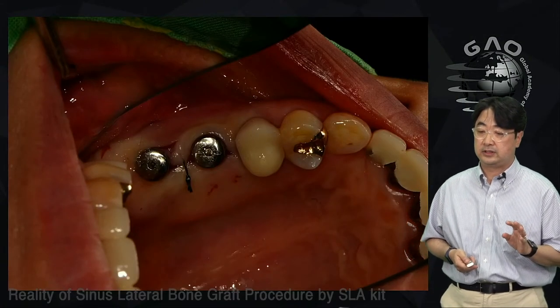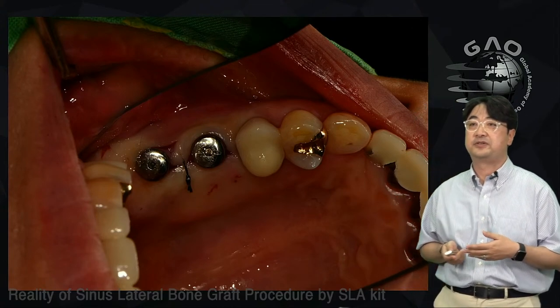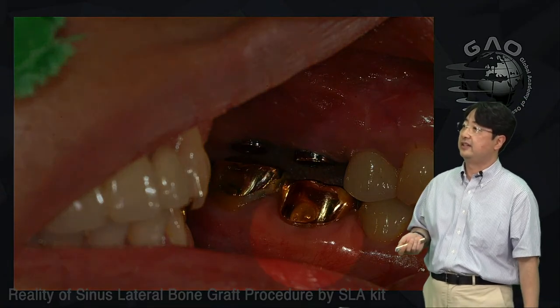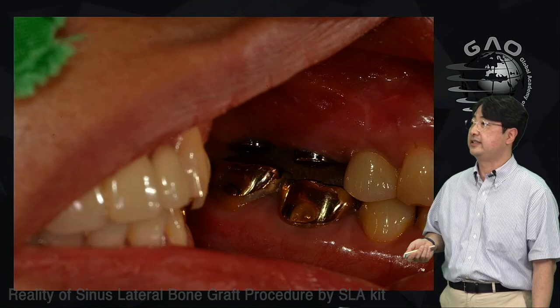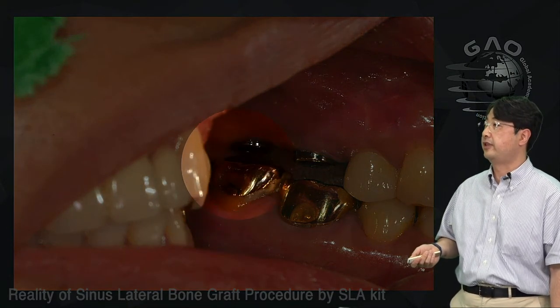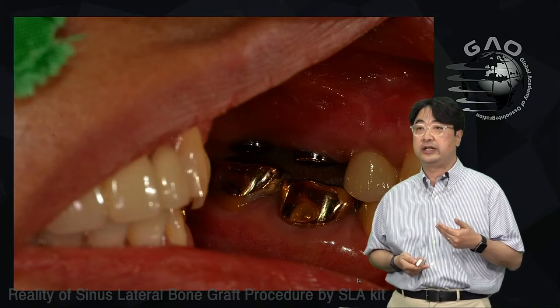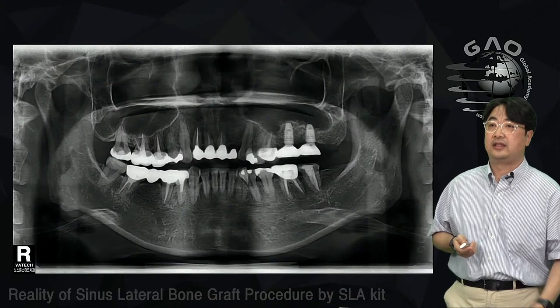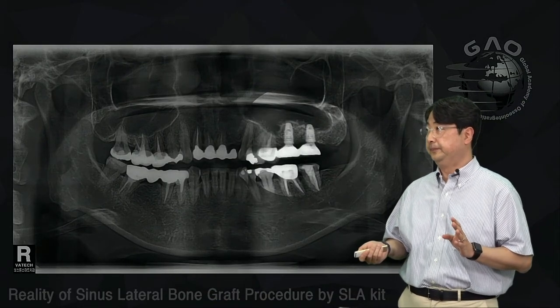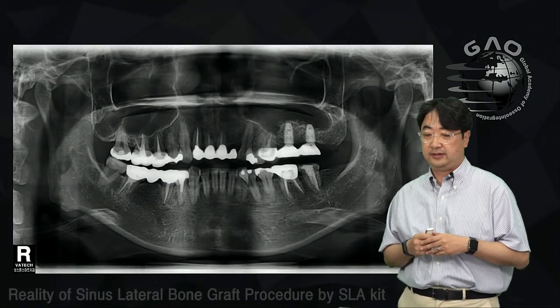Okay, so this is a clinical picture of the healing abutment after second surgery. Here you see there is not much space, right? So I decided to redo the number 37 crown to replace number 37 and create the space. So this is the final restoration on the cast, and the panoramic radiograph after final restoration, like this.